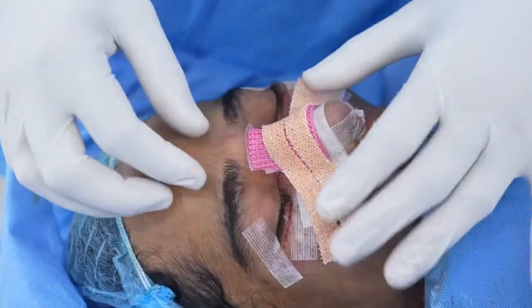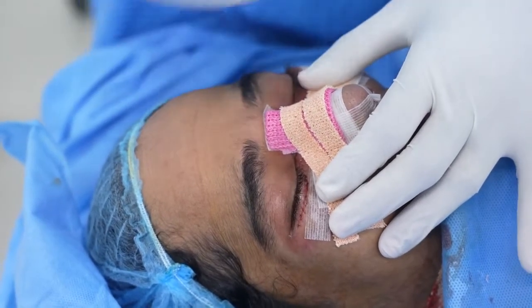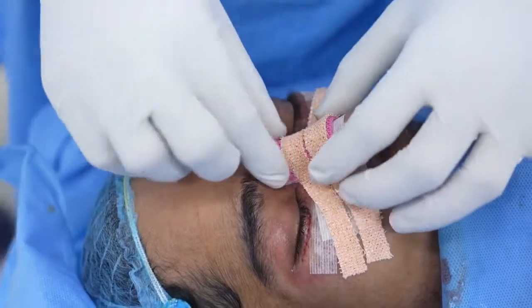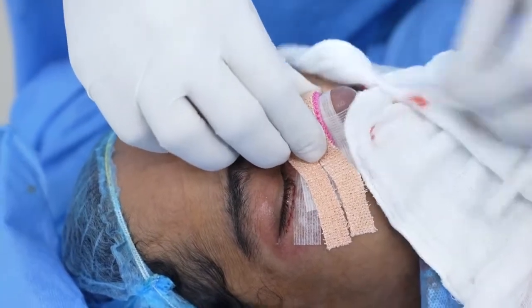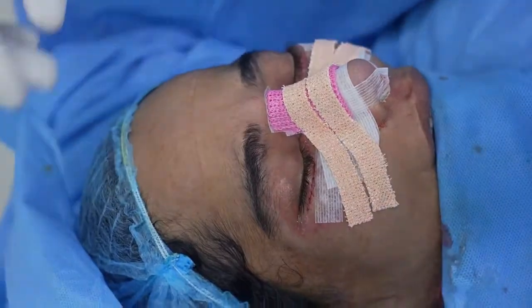So we're done. So that was a steri strip put by our anesthesiology team for anesthesia. Just gonna make sure this is fine and tight. It is. So there's no ooze. All right. Thank you.